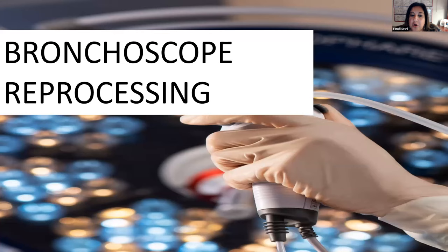So as we know, bronchoscopes are in contact with mucous membranes, and we don't enter sterile tissues or the vasculature with the actual scope. So devices in this category warrant a high-level disinfection. When a bronchoscope is used for a procedure that breaches the mucosa, it is then recommended that the accessory that breaches the mucosa is either single use or undergoes sterilization. That's why most of the tools that we use in the suite now or on the floors or wherever we go are disposable things that we're doing. So these are your EBUS needles, your forceps, your brushes, even your cryo probes.